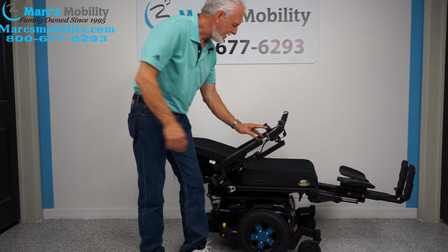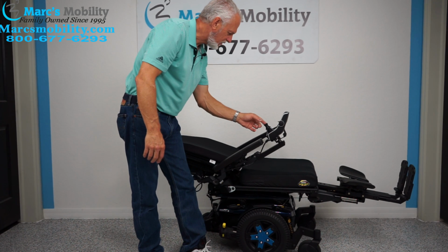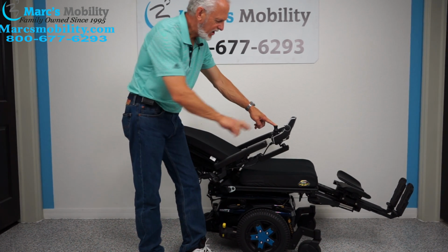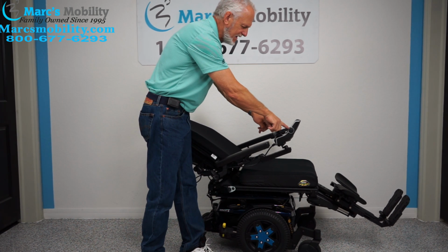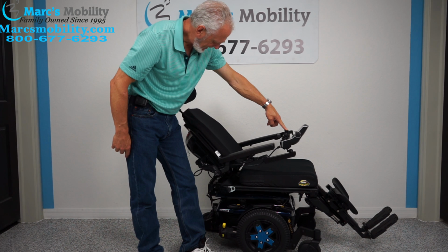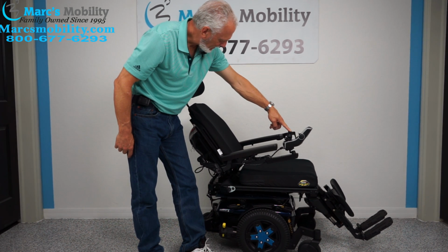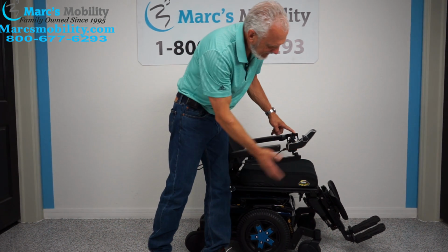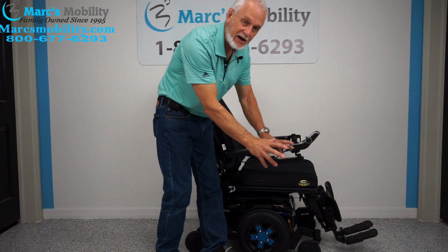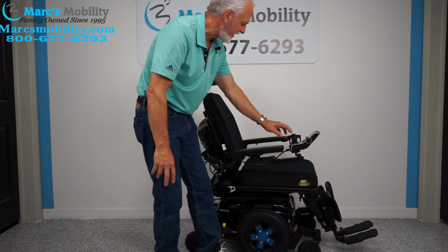So I'm going to bring the back up and the legs at the same time, just to show you. You can do two functions. So I have the legs in yellow and the back in yellow, and I'm moving the joystick forward. And now, look at that. If you're outside, make sure you leave those legs out so you have more room. You don't want to be jamming those legs in the sidewalk. They're very expensive to fix.